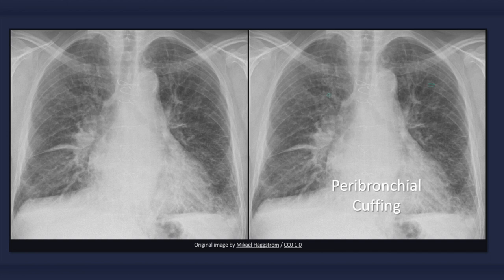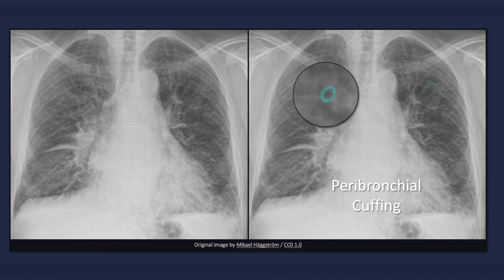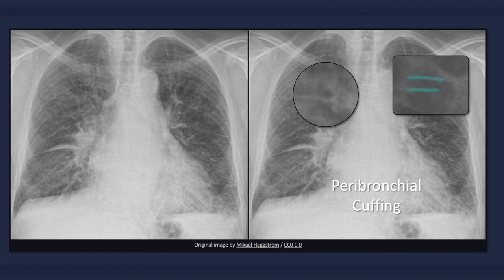Peribronchial cuffing is another discrete finding, which occurs due to edema of the bronchial wall. When viewed head on, it appears as a donut or a ring. When viewed tangentially — that is, from the side — it appears as two parallel lines, which to some extent resemble tram tracks. Note that peribronchial cuffing can occur in other conditions as well, such as chronic bronchitis.